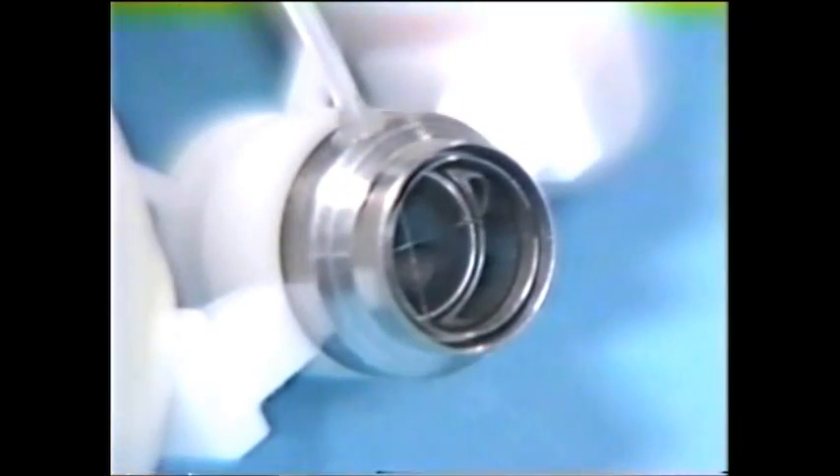A continuous 360-degree suction chamber holds the trephine head positively on the cornea. This is critical for attaining a stable perpendicular relationship between the trephine and the cornea prior to placement of the trephine on the cornea.